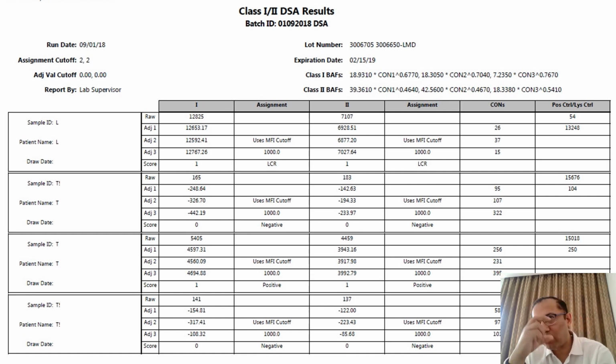These capture antibodies with HLA act as the donor antigen, and from the patient you take the serum, that is the patient's antibodies. They are mixed together and detected through a secondary antibody, like we have in red cell serology as well. So basically it is a crossmatch which utilizes the lysate to have HLA captured by the capture antibody, and if an analyte is present, it is detected by the secondary antibody.